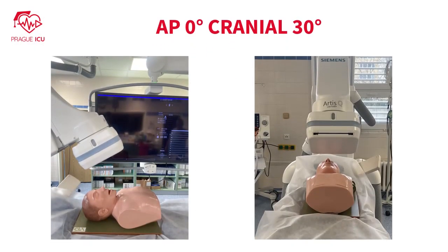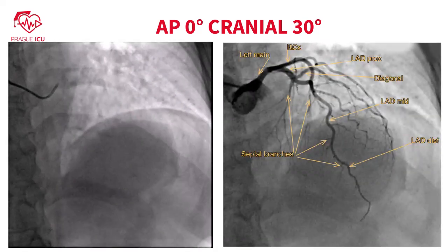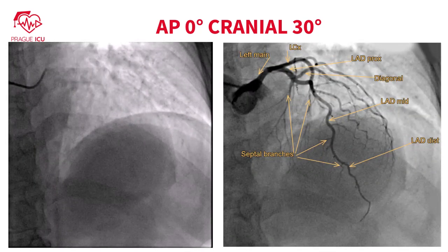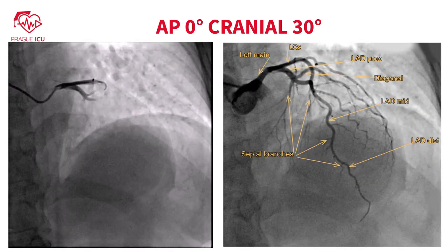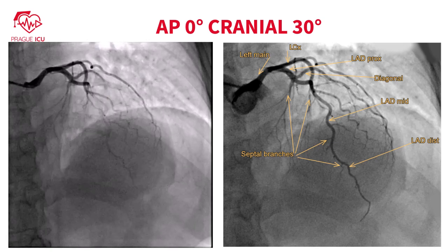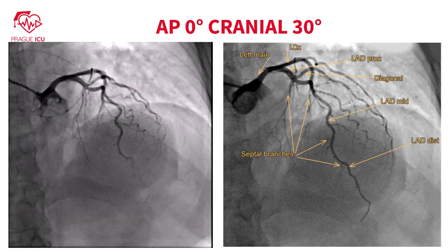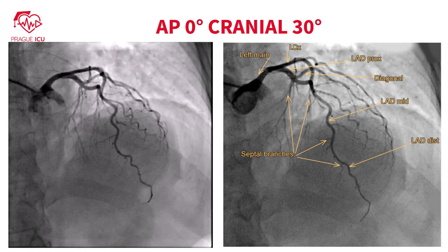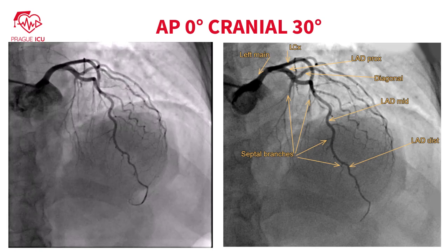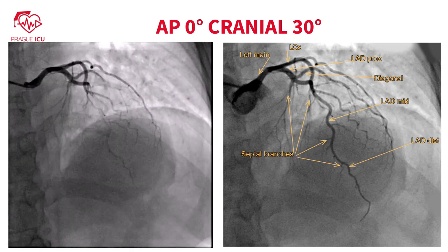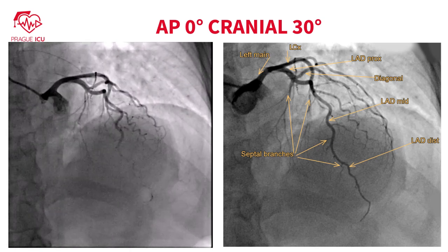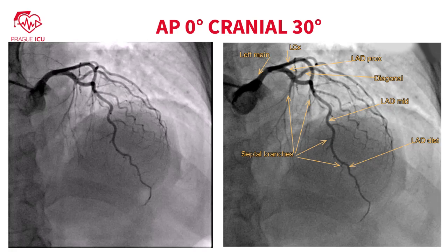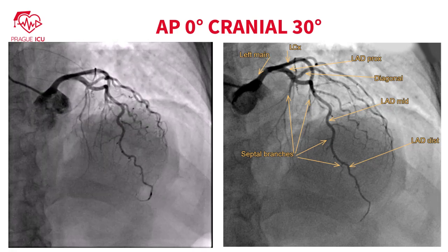AP 0 degrees cranial 30 degrees view is best for visualizing the distal part of the left main and ostium of the LAD. In major cases, the LAD goes in parallel to the spine. Diagonal branches go in the direction of obtuse marginal branches.